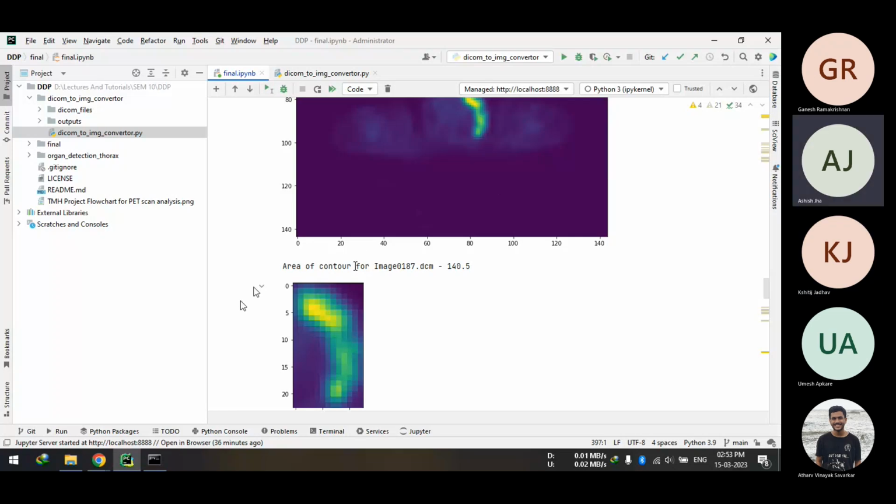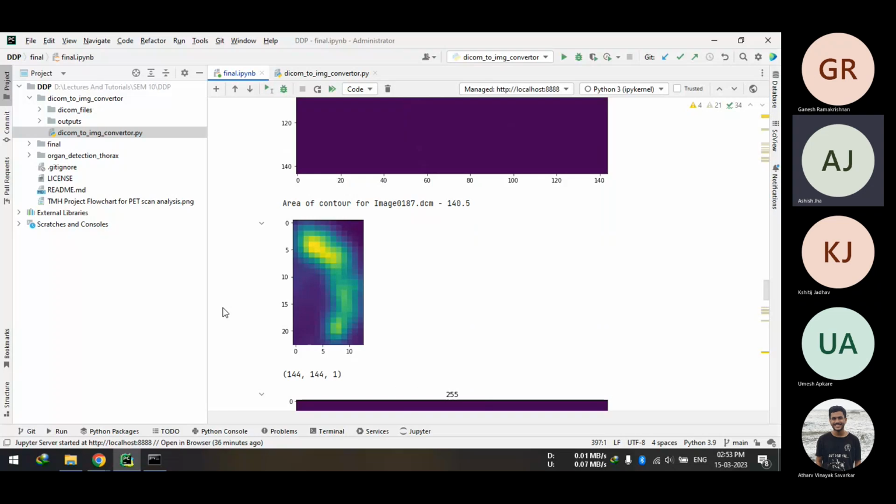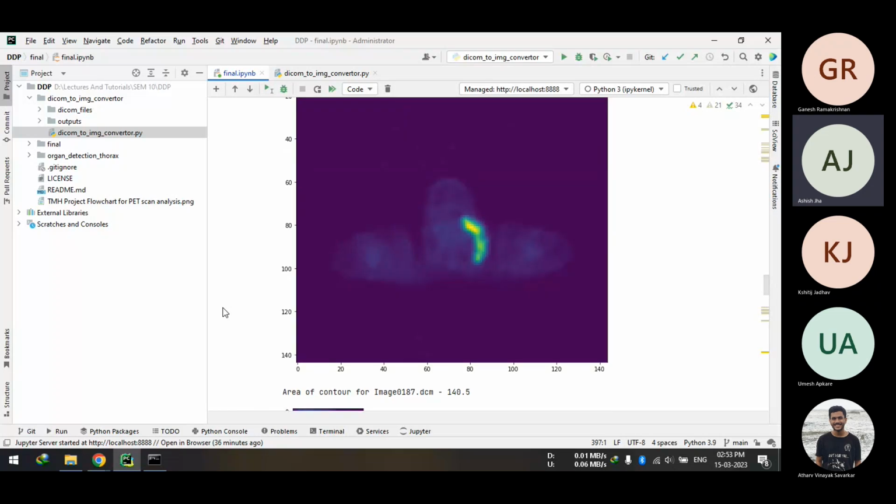So Atharva, you have contoured this tumor on PET, right? Yes. I think if these things are ready, then we can try out many things like TLG over here. Correct. Sure. So I will send you the formula of TLG and the other features, and then you implement it and see. Sure. That would be very easy.